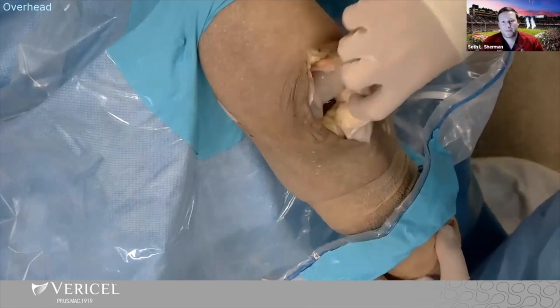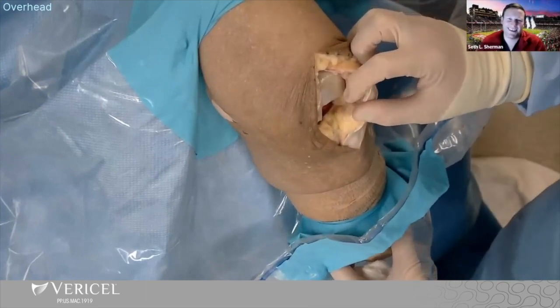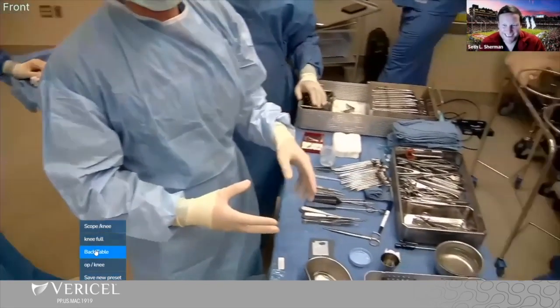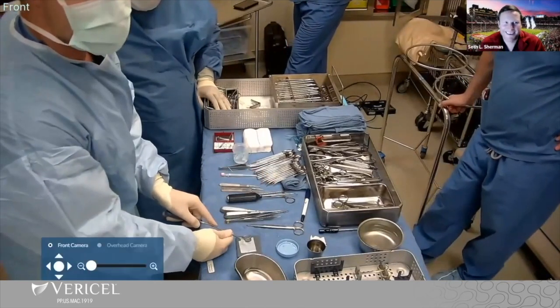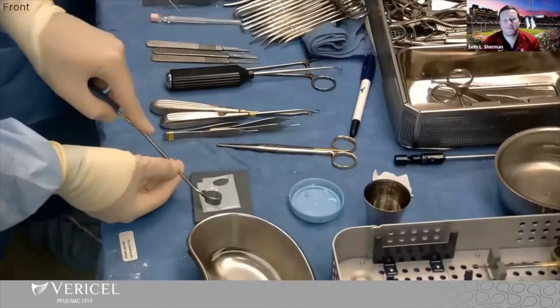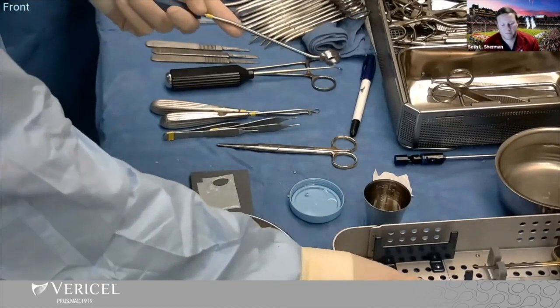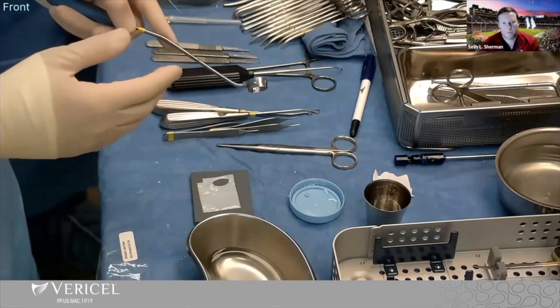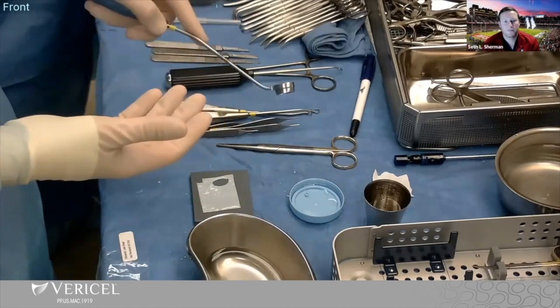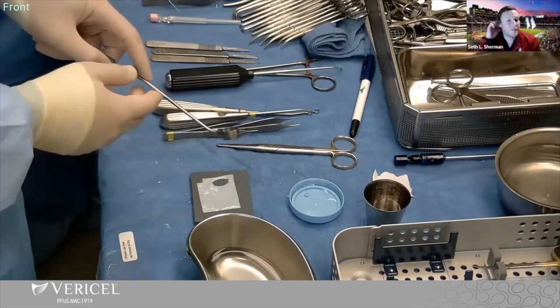You can see here — hopefully it stayed on. Oh nice, perfect. You can see that fits really well. Even with the substitute adhesive and not the real sealant, that's pretty good. Let's go back to the table — this is really important when we start doing multiple defects. You can see where I put this cut — it's not an accident. For cases where I have two or three MACIs, I'll cut them and it looks like a little jigsaw puzzle. I'll match out all the defects and try to make sure I can get them all from the same MACI. I usually order two implants and have those as backup for multiple defects. I always try to maximize each one of these pieces.